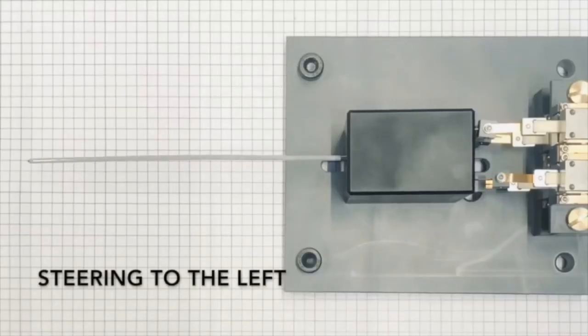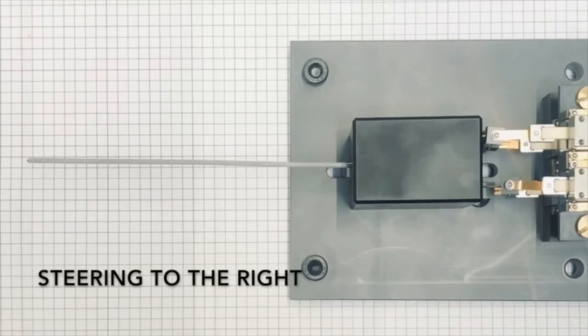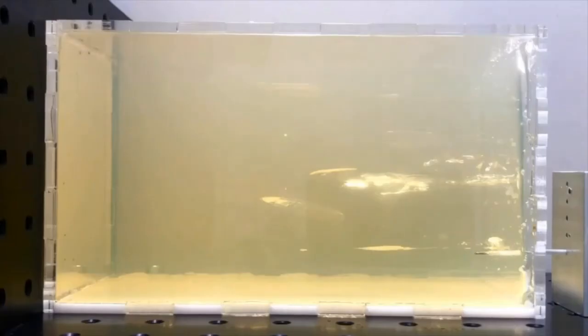At the proximal end, the segments of the inner needle can be attached to 4 piezoelectric motors used for actuation, as you can see over here. Needle tip steering up to 50 millimeters can be achieved by the use of a pull-push mechanism integrated in the needle system. Linear movement of the motors on the proximal end allows for steering at the distal end of the system, as we can see in the video. Here you can see steering of the needle when puncturing a gelatin phantom as well.